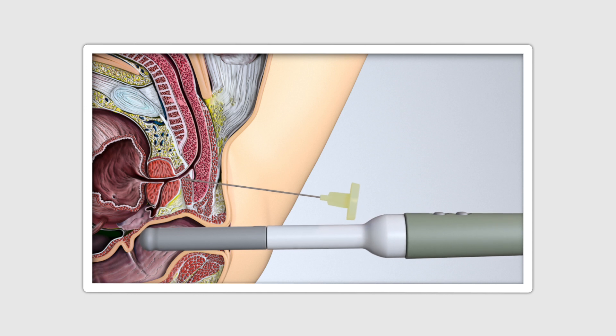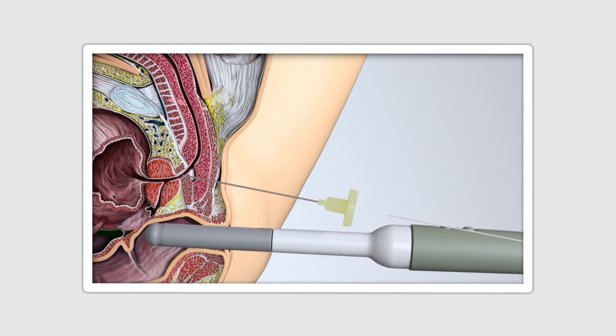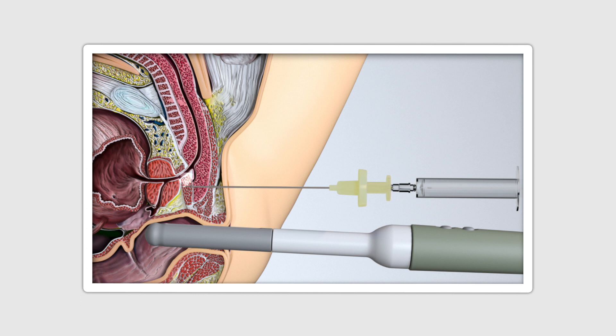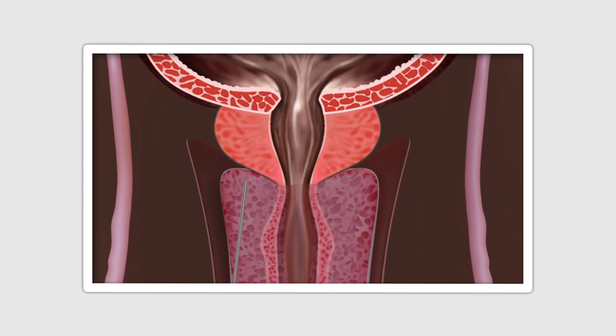The free hand movement that the CAMPRO probe affords means that apical areas of the prostate as well as basal and lateral areas are easily accessible. If the positioning of the cannula needs to be altered, this can be easily achieved by reinserting the local anaesthetic needle and cannula, and if necessary deploying a little more local anaesthesia. In our pilot trials, we have found that separate skin punctures are almost never required because of the malleability of the perineal skin and subcutaneous tissues. Occasionally, withdrawal beyond the pelvic musculature may be necessary in very large prostates.